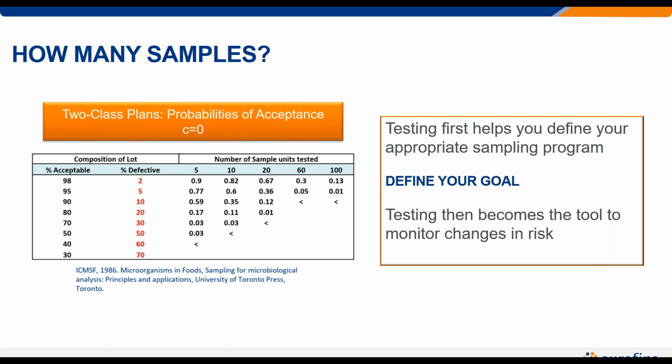I know I've looked recently in certain testing documents, and that's what it effectively describes about N equals 60, which is true if you have a 5% prevalence rate. So if everyone just thinks back for a second of how many times you find positives on your product. If it's not 5 out of 100, then you're not at 95% confidence rate with an N equals 60.